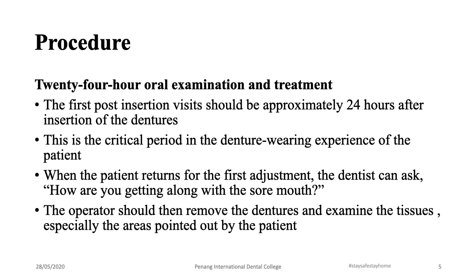If the patient is going to leave the dentures outside because he feels that there are certain areas where it is impinging and it is not possible for him to wear them, these sore spots in the oral tissue heal, and then eventually you will not be able to find them and correlate these sore spots on the impression surface of the denture and trim them.